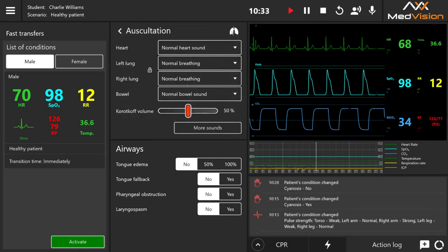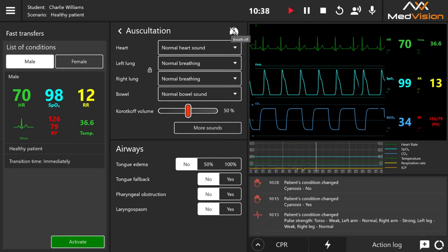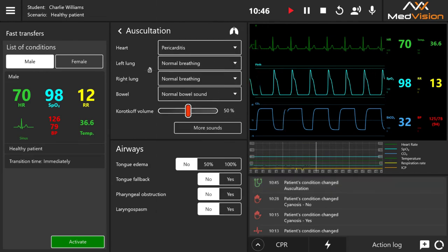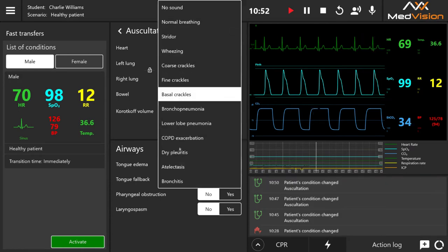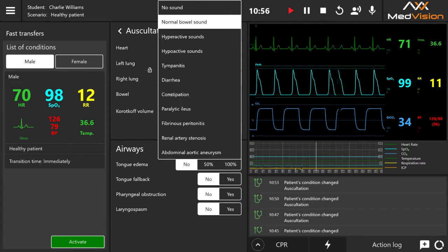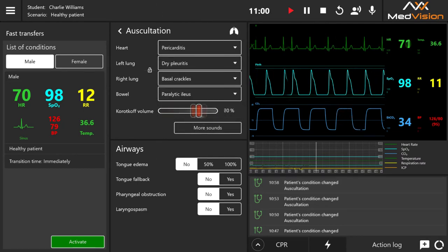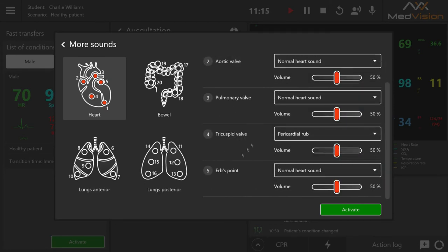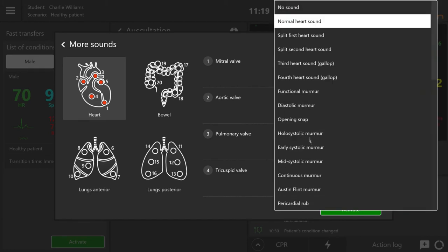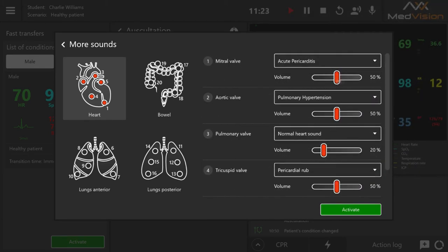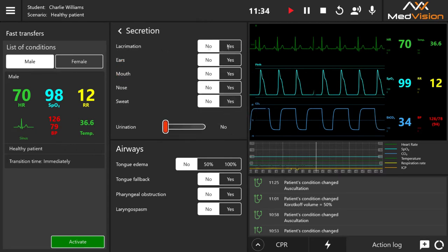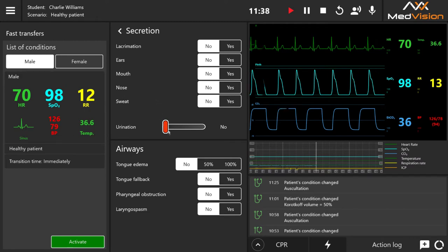In the auscultation menu, an important setting is turning off the compressor for higher fidelity sound without interruptions. You can choose heart sounds, lung sounds bilaterally or unilaterally, and bowel sounds including diarrhea, constipation, and paralytic ileus. Under 'more sounds,' a special menu lets you configure each auscultation point individually — for heart sounds you can control mitral valve, aortic valve, pulmonary valve, tricuspid valve, and Erb's point, setting different sounds and volumes to create custom pathologies. The secretion icon shows all secretion settings and urination settings.